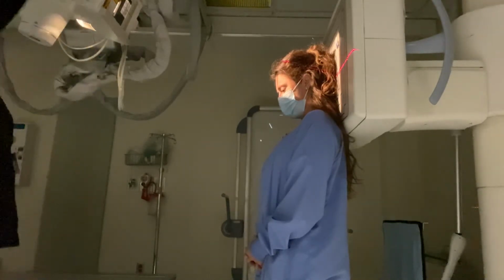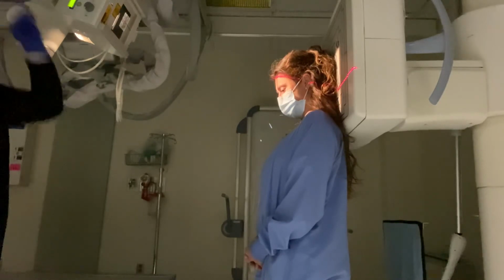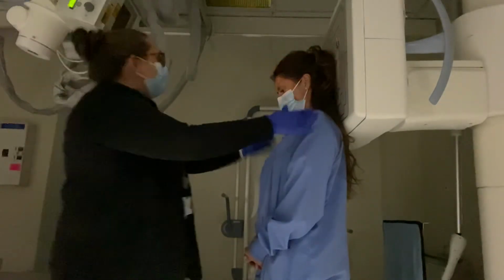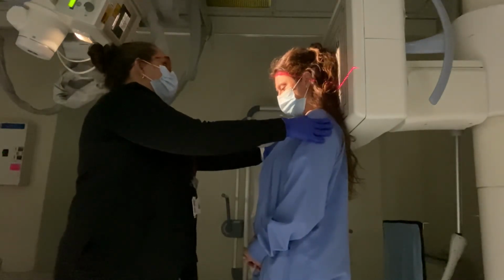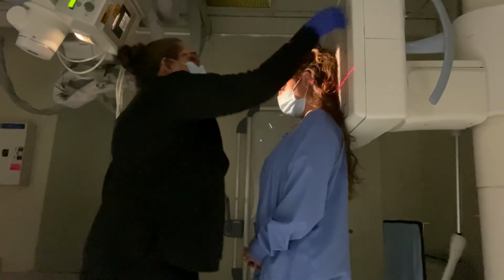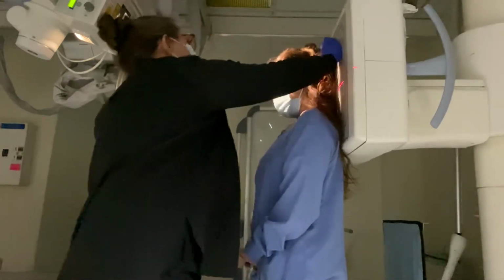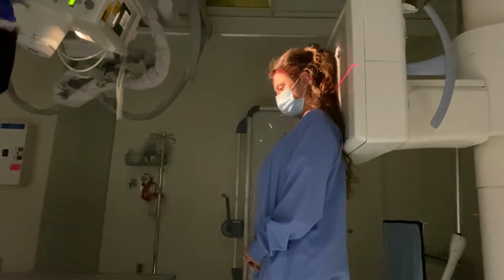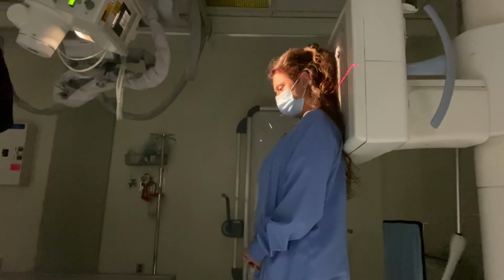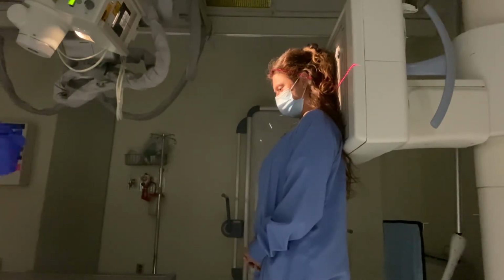And then I want to center 2 inches above the glabella, which happens to be, for most people, at the hairline. And then I want to make sure that I'm centered to the mid-sagittal plane, so I'm going to scooch her just a little bit that way. Lower this down a bit. All right. And again, it's important to make sure that you have light above the top of the skull so that you're not clipping everything, especially with that large angle. So I'd have my patient hold nice and still just like that.